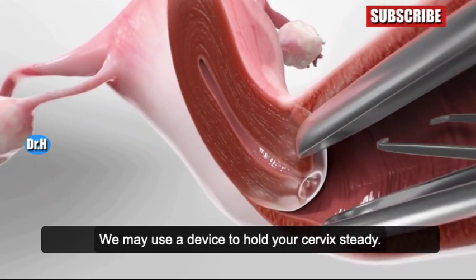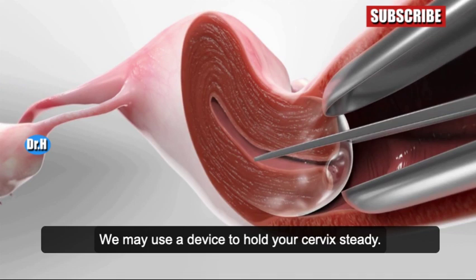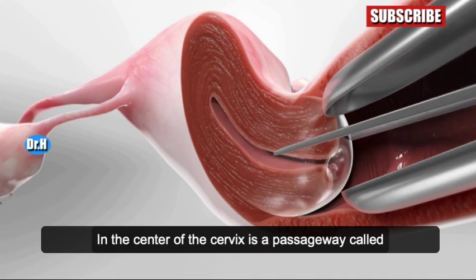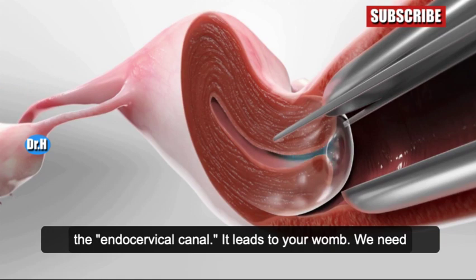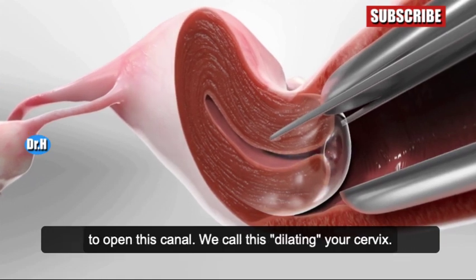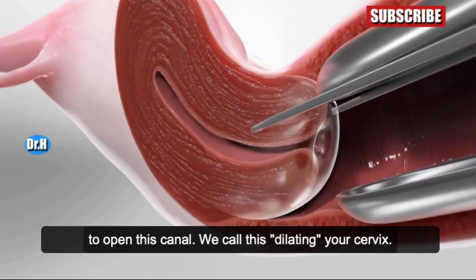We may use a device to hold your cervix steady. In the center of the cervix is a passageway called the endocervical canal — it leads to your womb. We need to open this canal; we call this dilating your cervix.